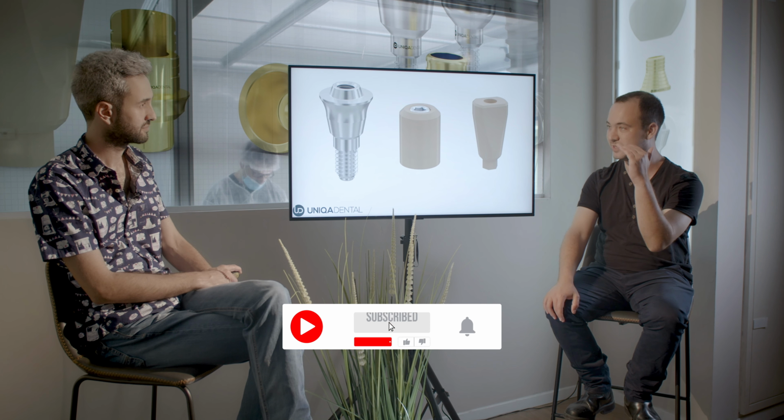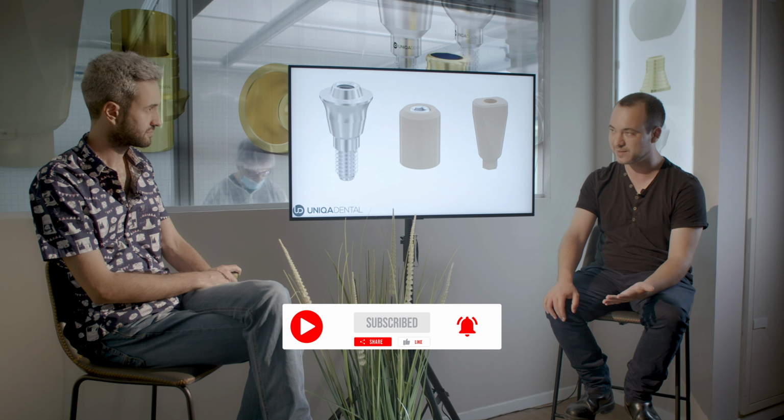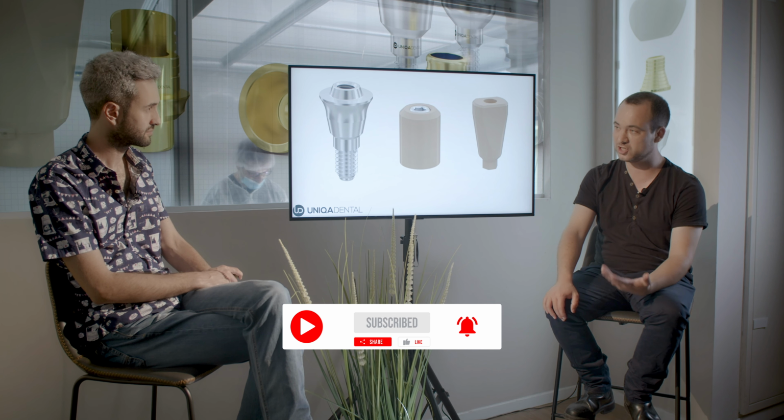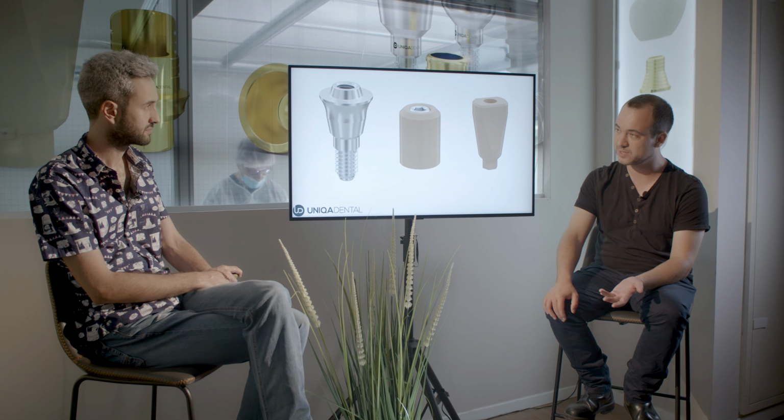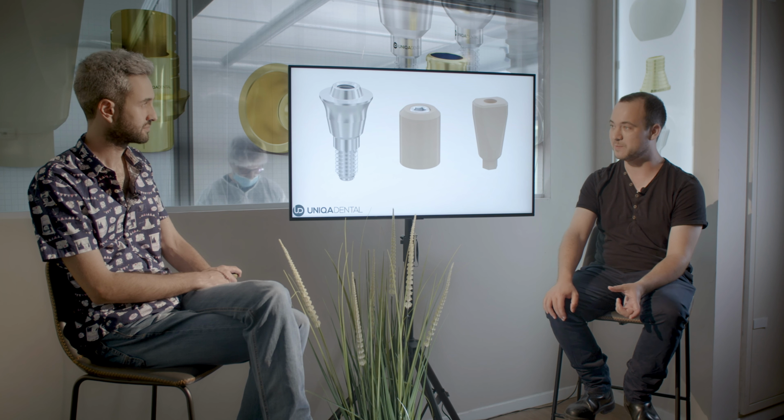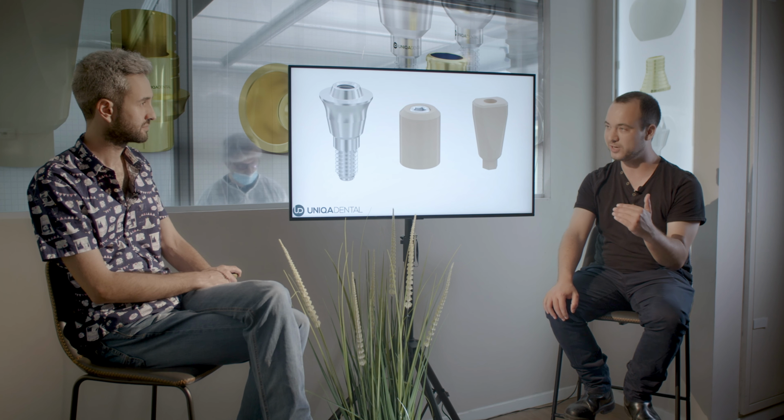For example, if you took on a 2 millimeter multi-unit, the height between the scan abutment and the implant is 2 millimeters. You can digitally change it to 1 or to 3 or whatever you want. So the height of the scan abutment will still be the same, but the beginning of the restoration will change according to the multi-unit that you'll use. This is when you're taking impressions on the multi-unit level.